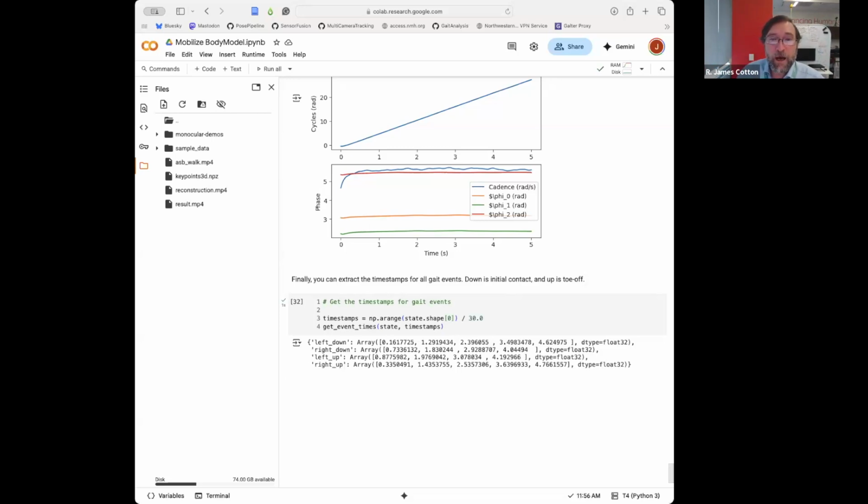As for measuring on a treadmill, we've done that. In fact, as part of some of our sports work we did recently, we collected a bunch of treadmill data, including with 120 FPS tablet video. And of course, we also do the drones following people. I'd almost go back to the motivation for BiomechGPT here. It's now relatively easy to capture high quality data, within caveats of high quality. But then what do you want to do with it? When you get onto a treadmill, you might want to correlate with treadmill speed and so on.